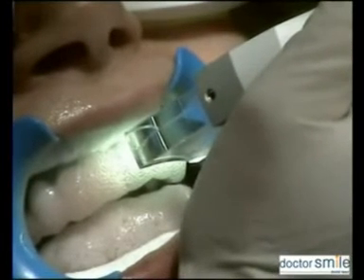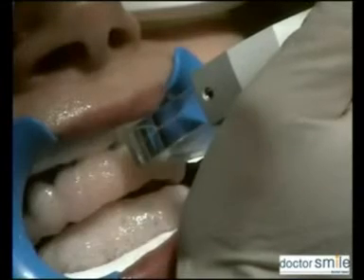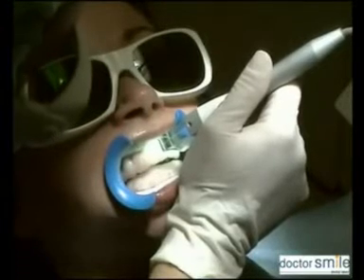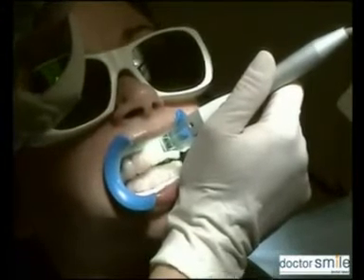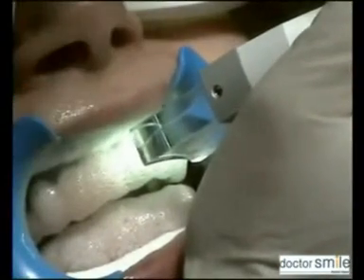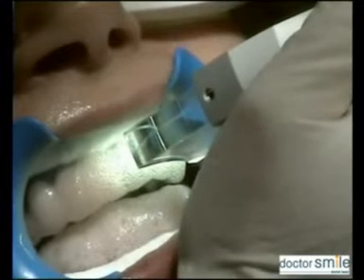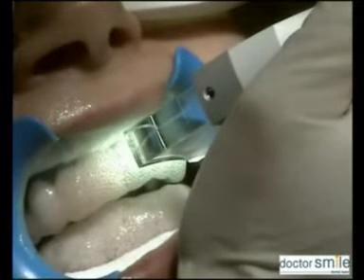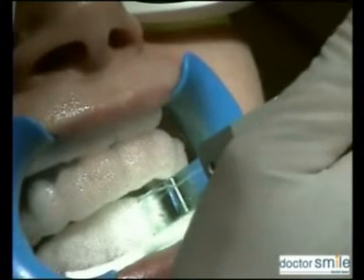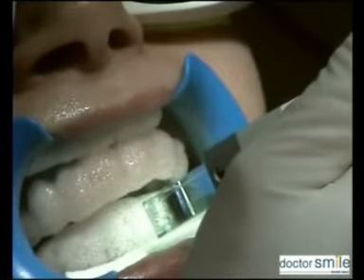Activate the gel by holding the handpiece in close proximity — about one millimeter — respecting the built-in time control. Fire for 30 seconds in each quadrant. When all quadrants have been fired, wait for an interval of 60 seconds, then start the same procedure for a total of three times. After the third time, make an interval of five minutes, then wipe off the gel.